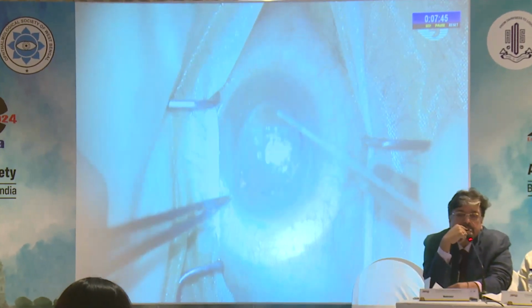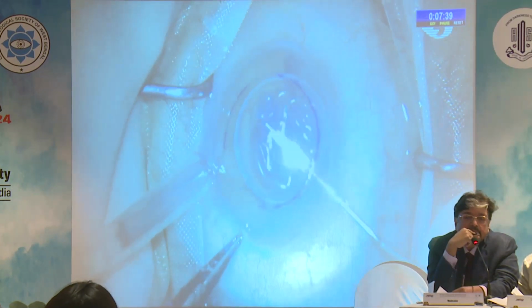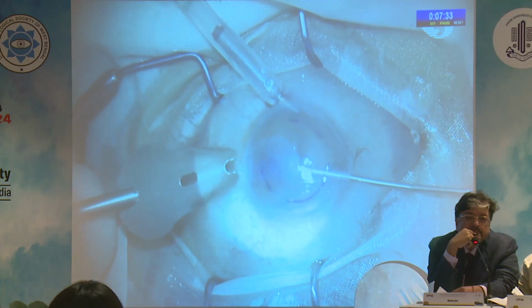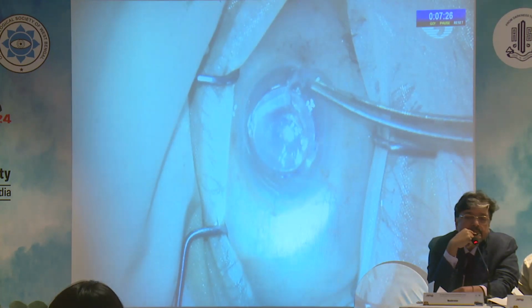Endothelial keratoplasty has evolved into a safe and effective way to treat corneal disorders affecting the inner layers of the cornea, and is preferred to penetrating keratoplasty wherever it can be done safely. Though the results are gratifying, there are certain situations where endothelial keratoplasty can be challenging.